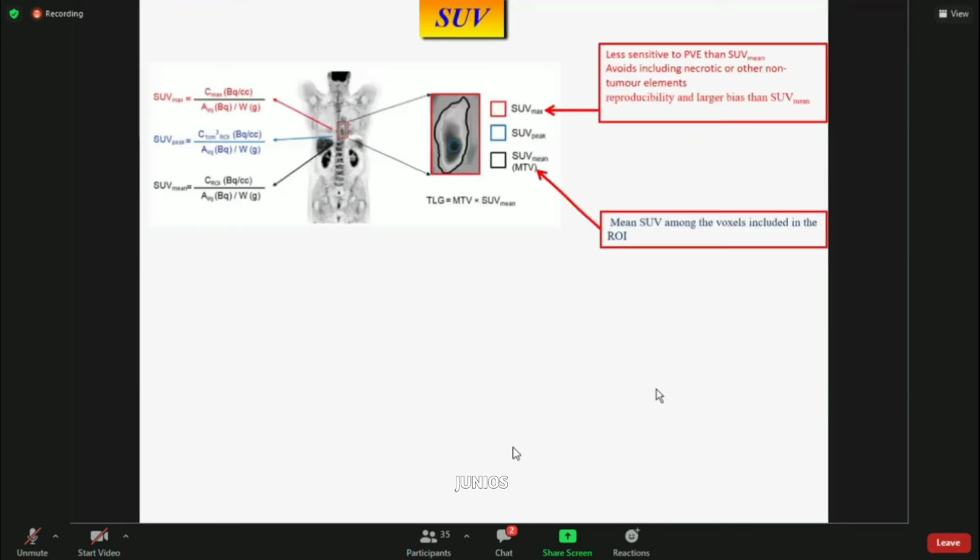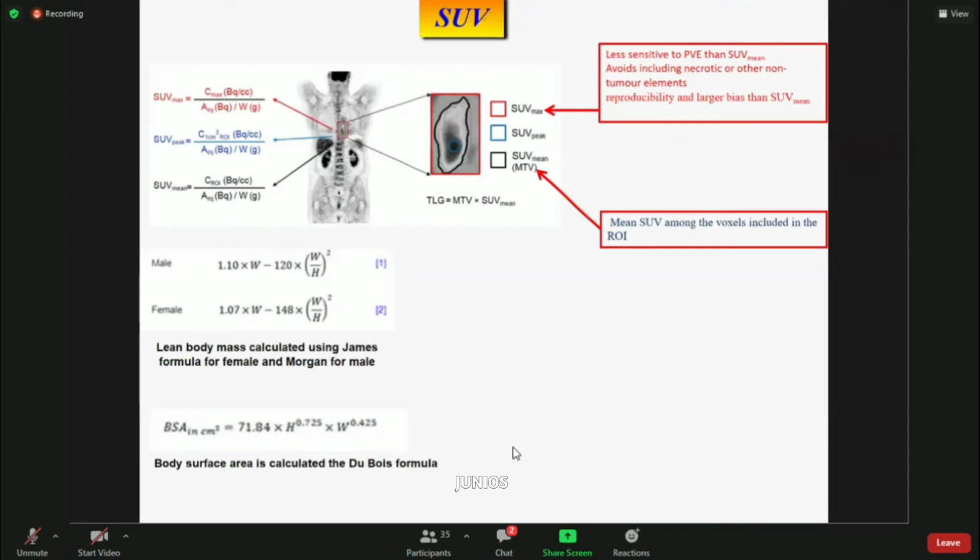It allows us to assess the uptake in an ROI irrespective of the administered activity and the patient weight. The use of SUV as a measurement of relative tissue uptake, to facilitate comparison between patients, has been suggested as a basis for diagnosis. However, the practice of using an SUV threshold for diagnosis is not widely accepted.